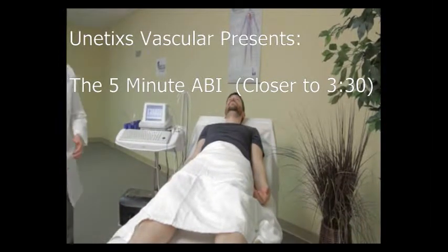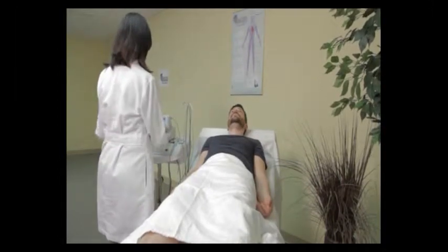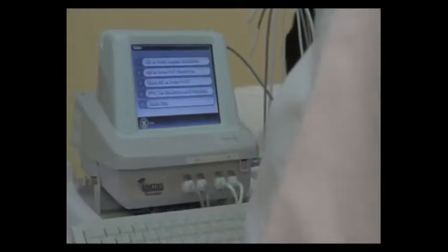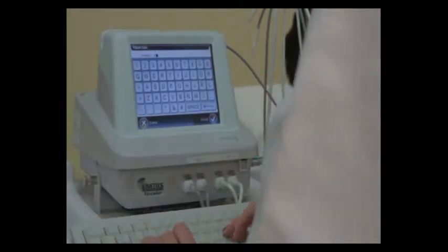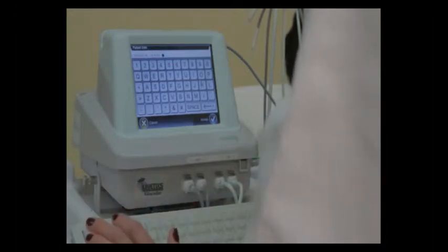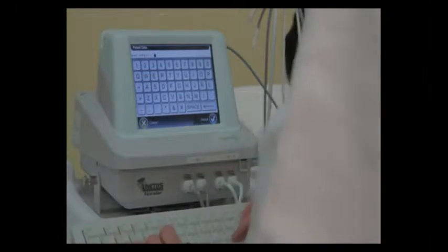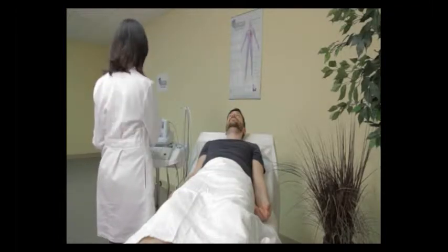In this video, we're going to demonstrate the REVO 1100 by Unetics and the 5-Minute ABI study. Our technologist is going to select the study from the menu, and then she's going to enter the patient name, the patient ID, the patient date of birth, the test name, the referring physician, and now she's ready to begin.